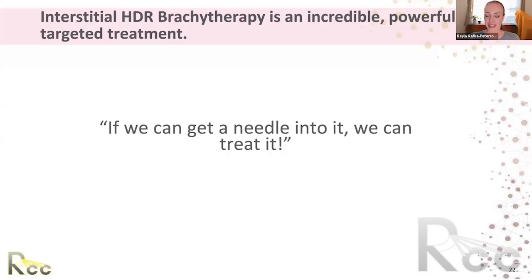And needles are not the only way to get to these tumors. Again, there's applicators, but needles are powerful with brachytherapy, and a lot of areas are really trying to see how far we can go with this, such as into the lung and into other areas. In very few centers, but I want to get the point across of how amazing and capable brachytherapy is. But the core of what we really need to do to reach people right now is to treat gynecologic cancer, and especially cervical cancer. If that was available to patients worldwide, the world would be such a better place, and brachytherapy makes all the difference for those patients.